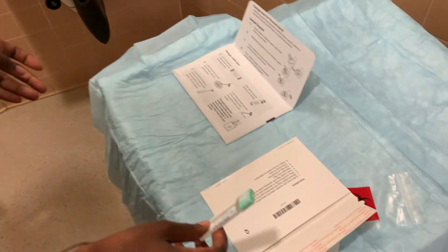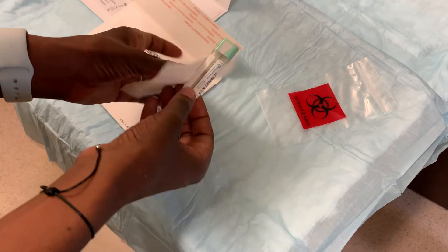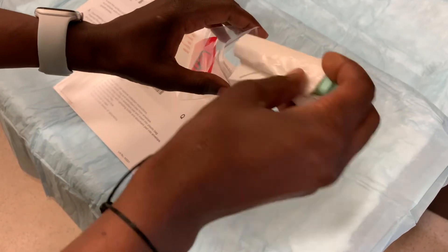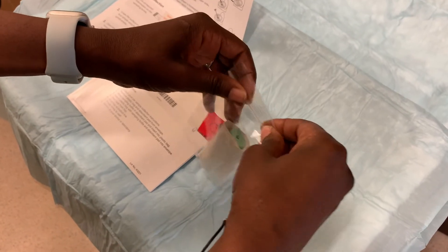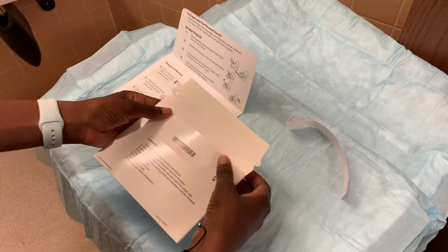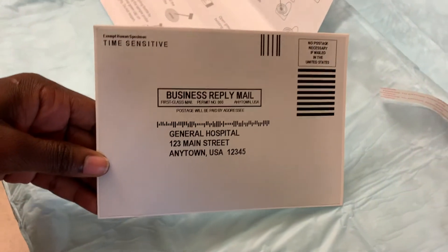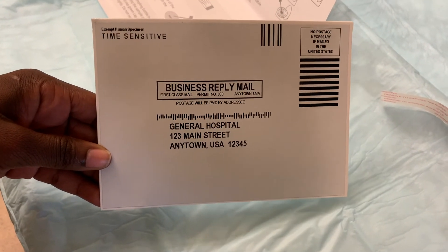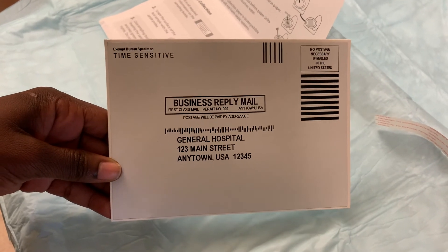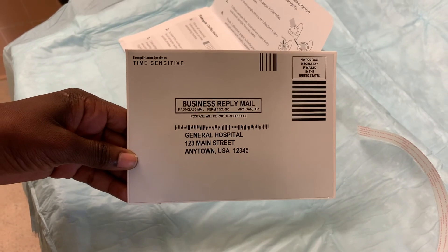Put the stick back into the kit and snap it closed. Do not reopen after you've sealed it. Take the tissue and wrap the sample, then place the sample in the bag. Drop the bag in the envelope, seal it, and drop it off in the mail within 24 hours of collection.